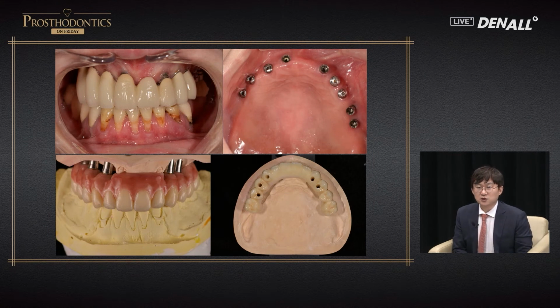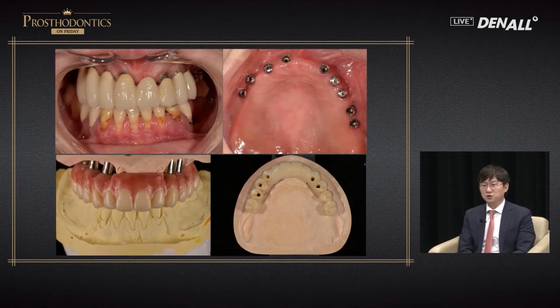If you look at the intraoral pictures, the patient is in her early 30s. If you look at the pictures, the implants were placed in another clinic. The condition is not very good. Aesthetically, the vertical dimension is low. The implants have crestal bone loss, and all the implants are not usable. It is very difficult to do the surgery again.